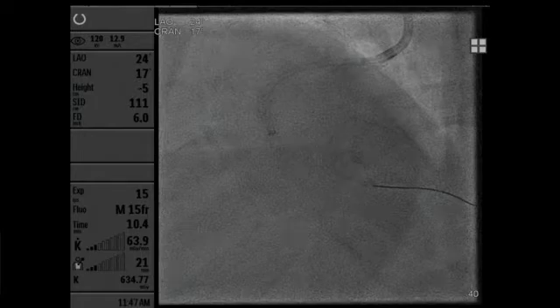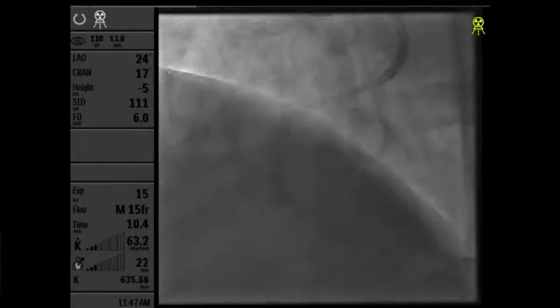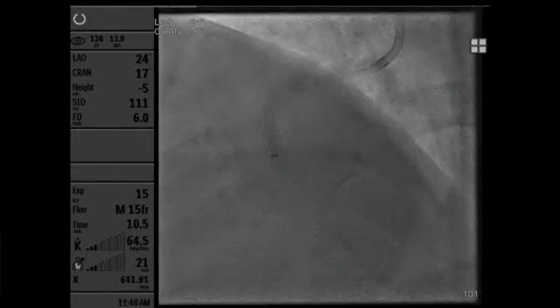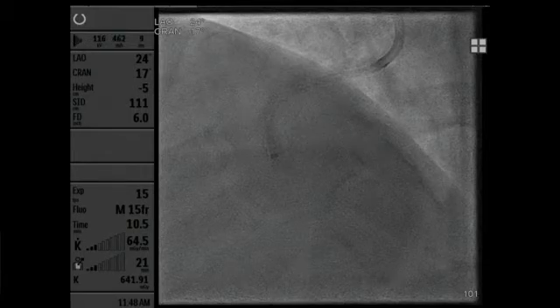Now, some of the work that's been done is by Margaret McIntaggart in Glasgow, looking at eccentric calcification. In the concentric lesions you get reverberation of the shock wave, so you get a sort of double effect from each shock. With eccentric, there's really only one, there's no reflection from the other side of the vessel.